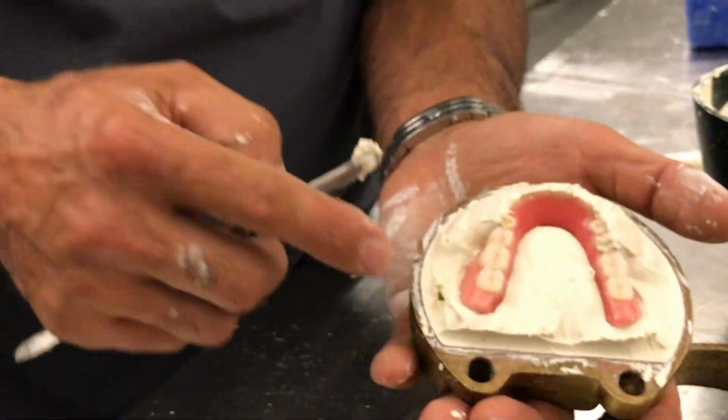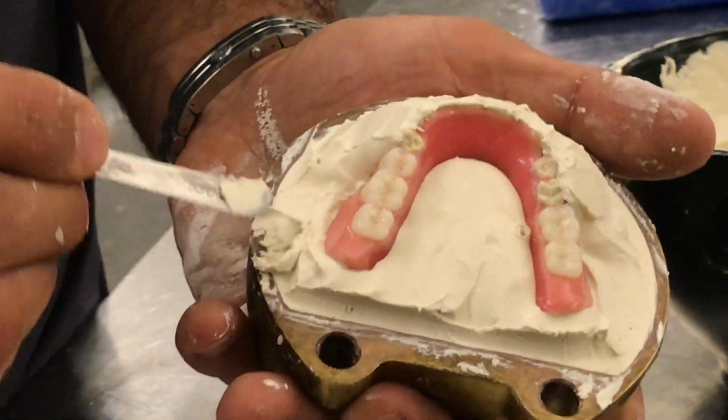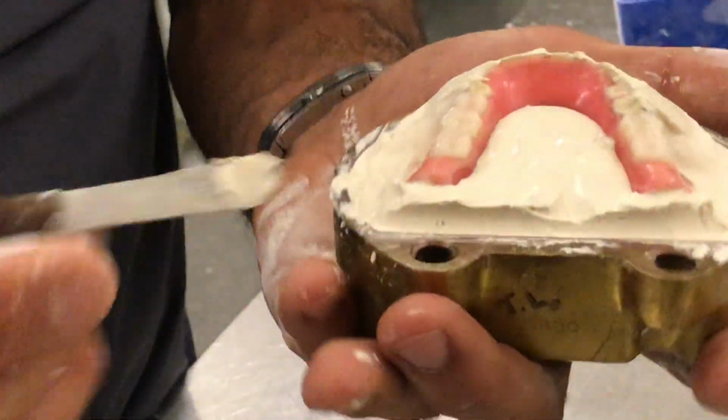And I realized a little void in here. I don't know if you picked that up. That's okay. You can just go back and kind of vibrate that in a little bit. Just fine.